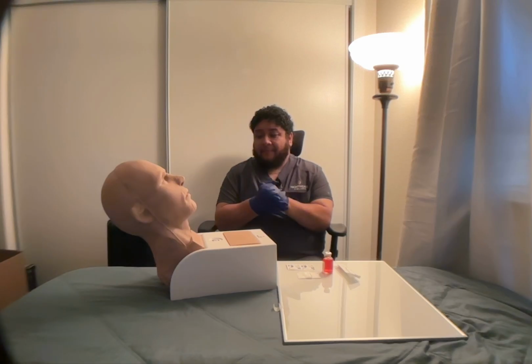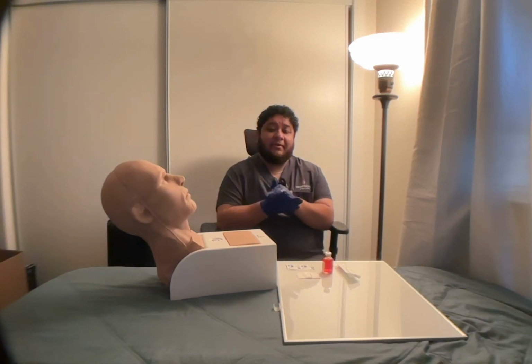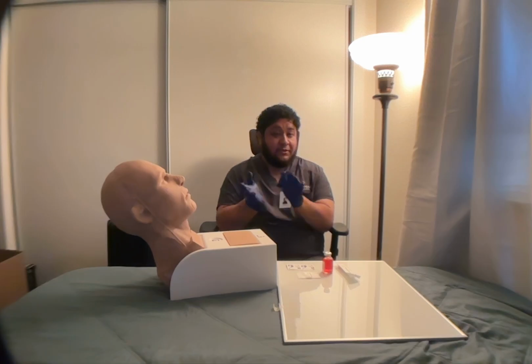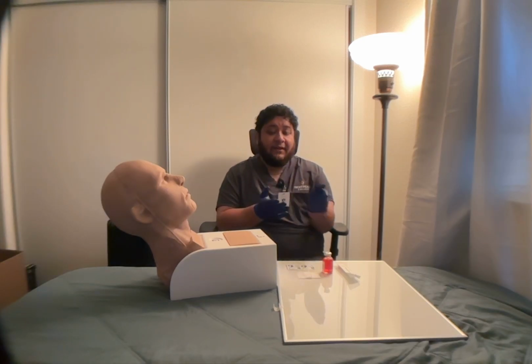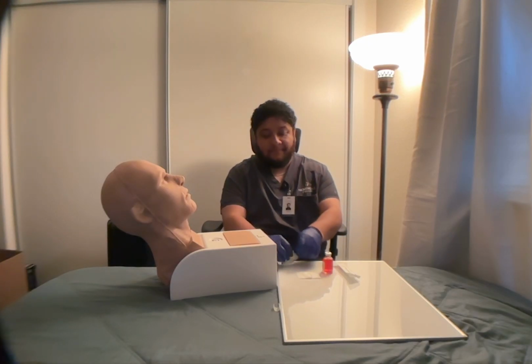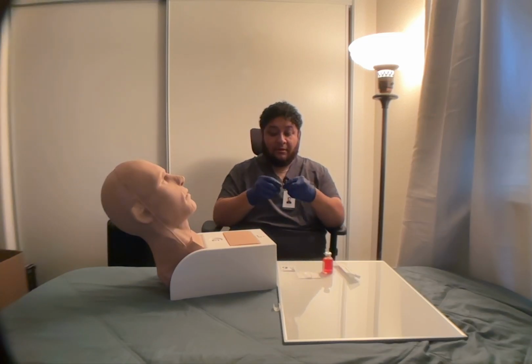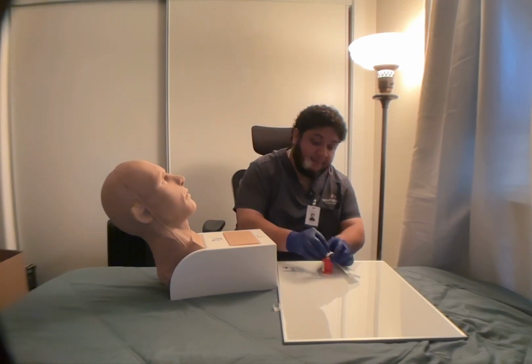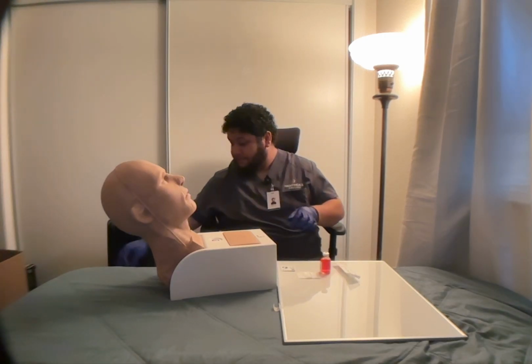No? Okay. Now I'm going to prepare the medication and verify for the 3rd time just to make sure that it matches up to the right patient, which is very important. Now I'm going to remove the cap of the medication vial if new. Since I've already been practicing, it's not. So I'm going to take an alcohol swab, dispose of my trash, and clean the top of the vial, like so. Dispose of this in the trash.